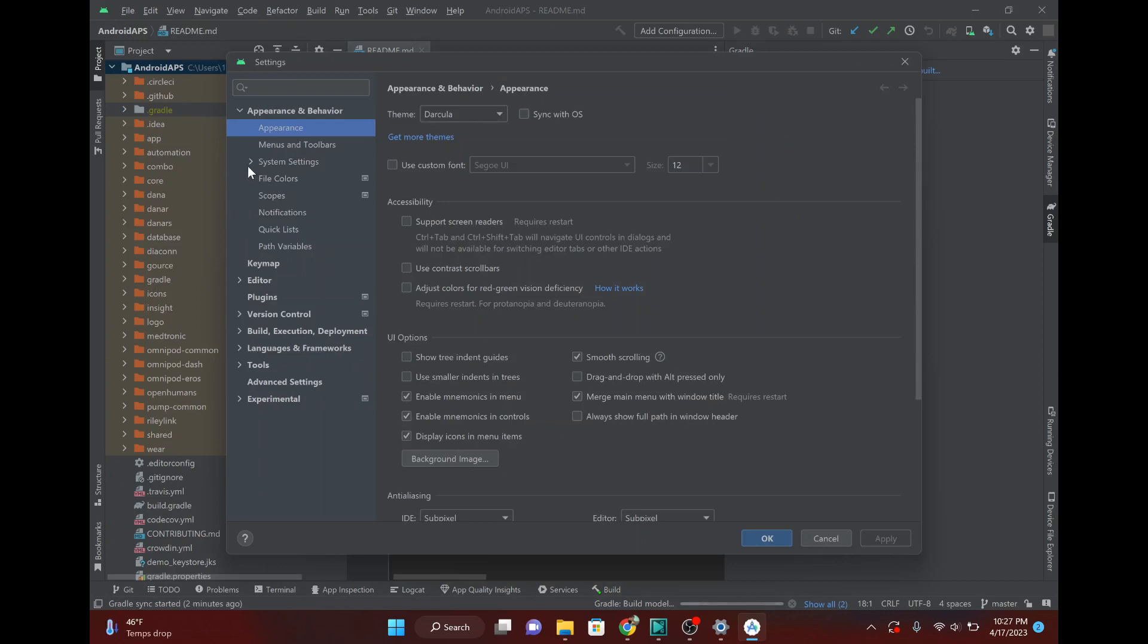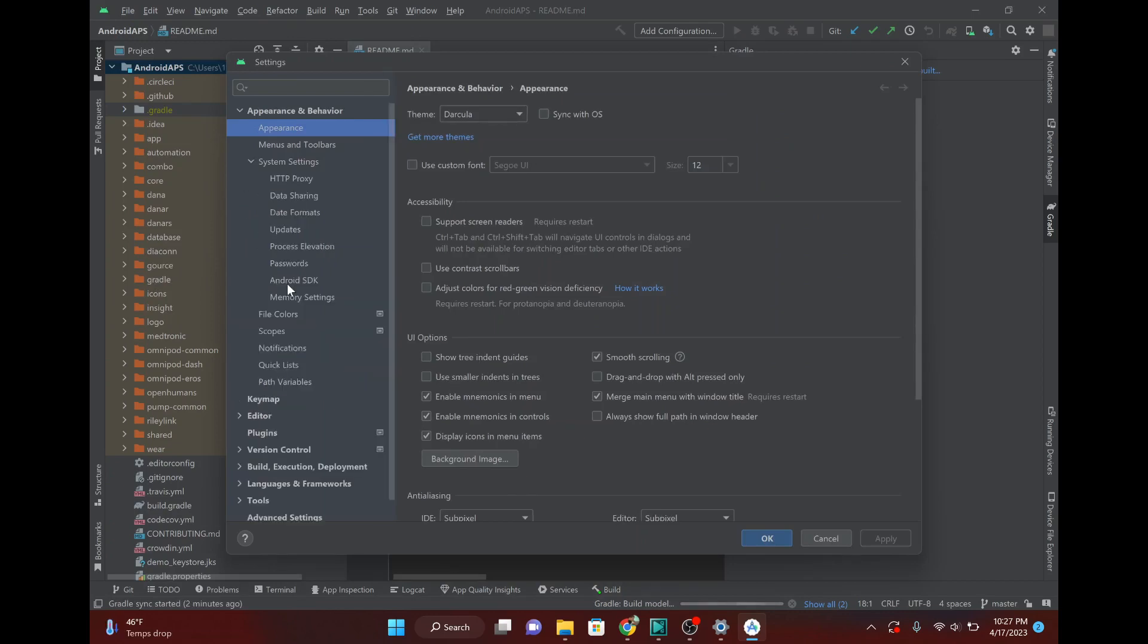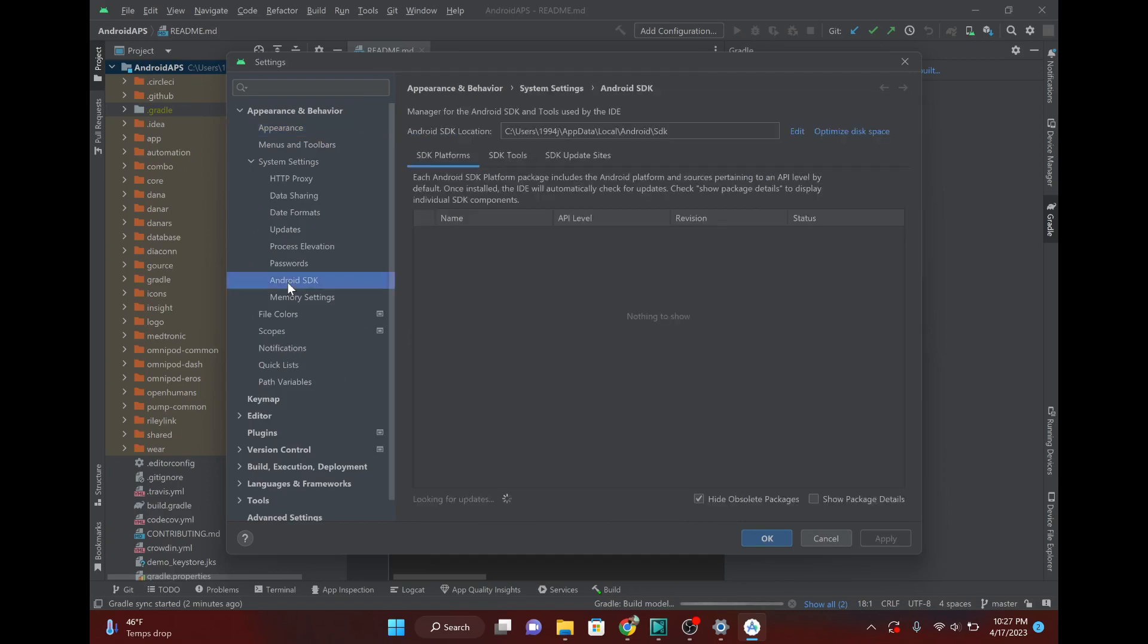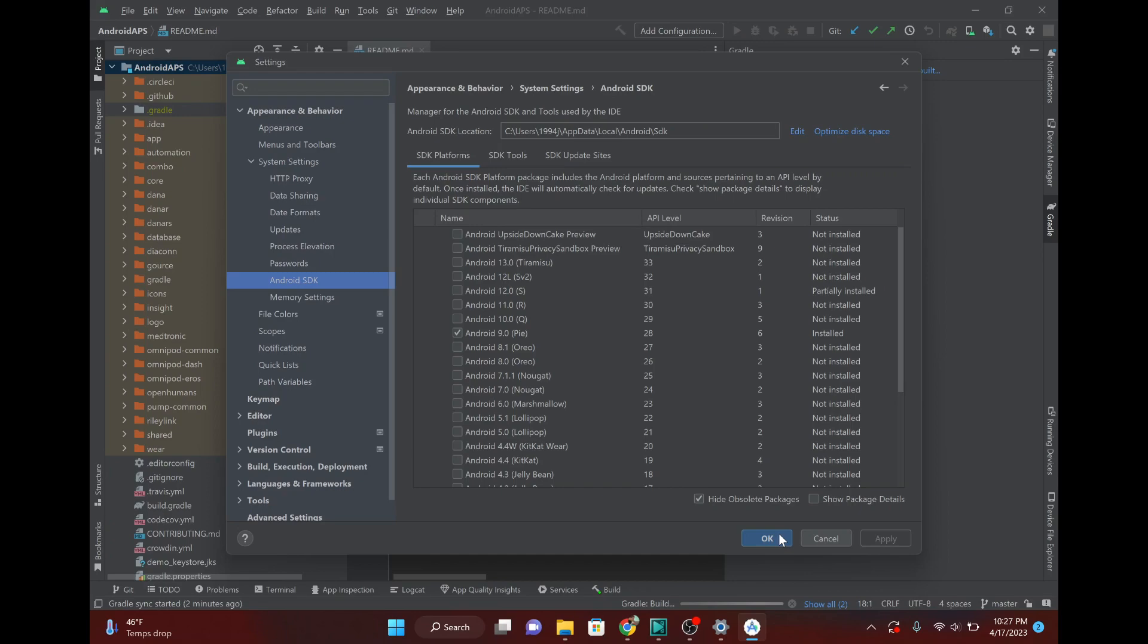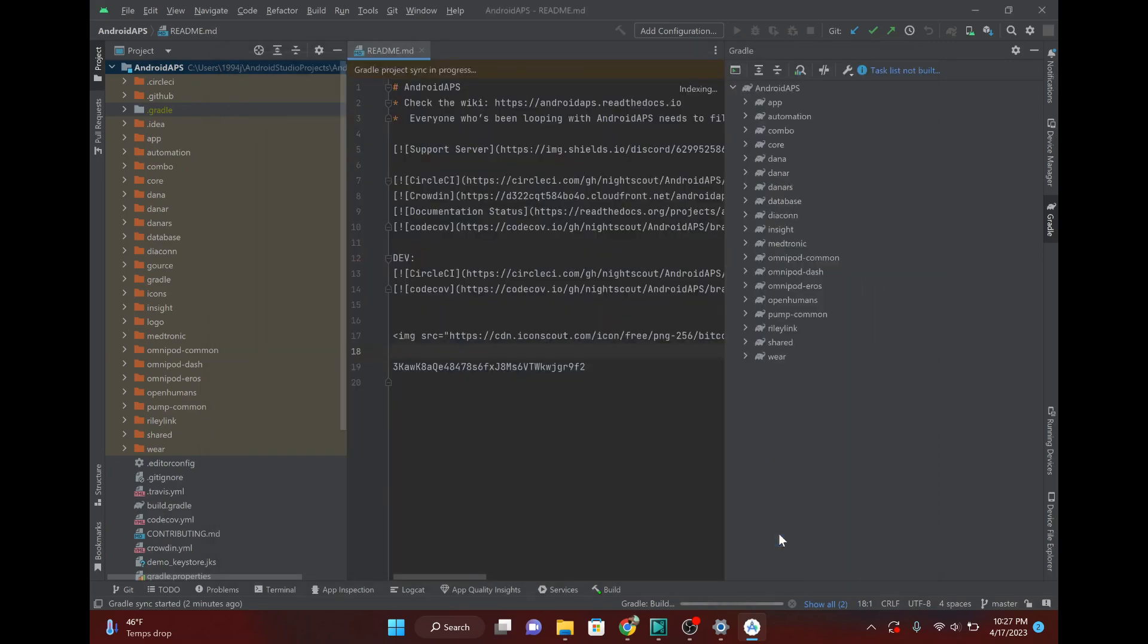And we want to hit this drop down next to System Settings, and Android SDK. And you just want to make sure that you have Android 9 installed. If you don't, go ahead and install it. Don't worry about any of the other ones. It's just Android 9, and it's the SDK version that it needs.